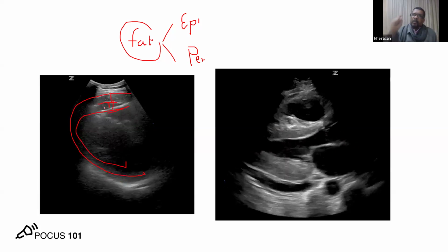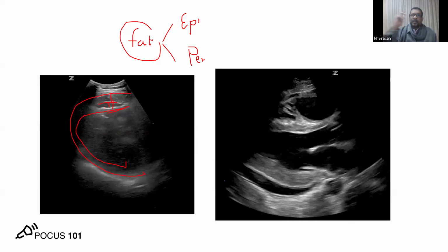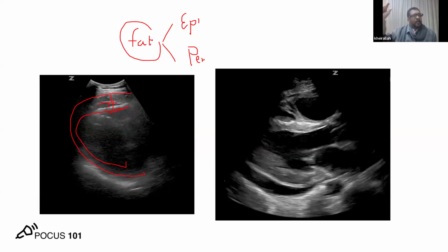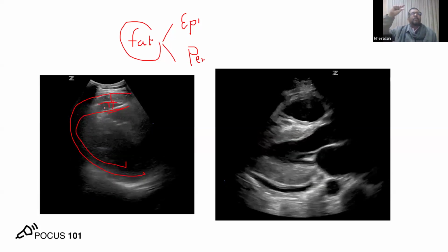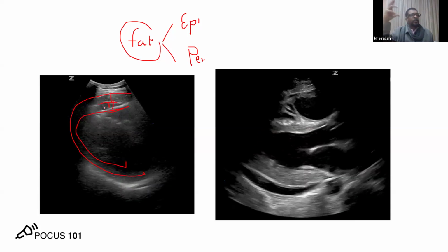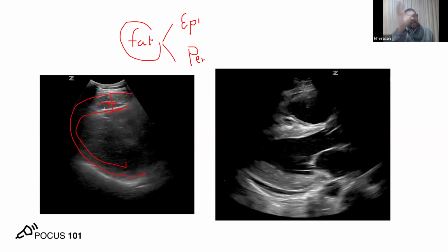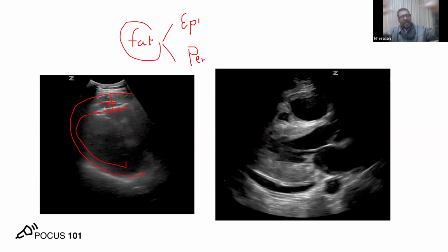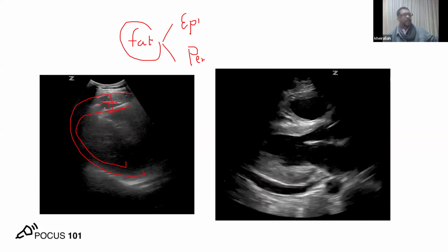I have seen patients referred to oncology, okay, and done PET and biopsy and lots of stuff because they have seen fat pads that are very accentuated and very robust, and they thought this is a mass around the heart. Yes. So we have to know that the heart is encased in a fat pool, okay? And this fat thickness depends on several factors.